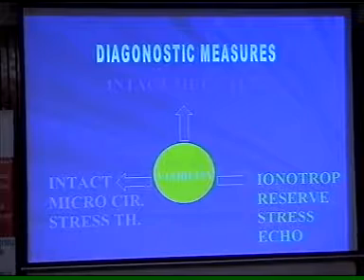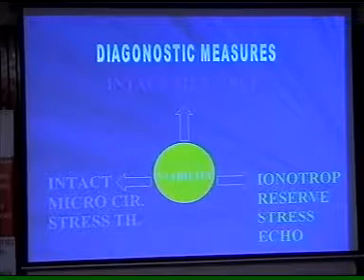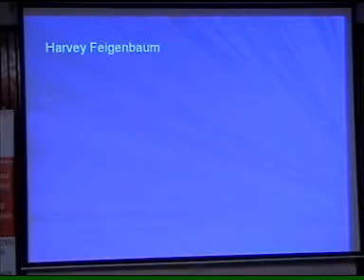So this is what you are achieving, and this leads to, say, hibernating or maybe viable tissue, and you use low dosage dobutamine, and that gives you a wall motion change during the test, and you can straight away tell that this is a patient having infarction, akinesis, but there is still viable myocardium left, so the patient may go for coronary angiogram and ultimately surgery.